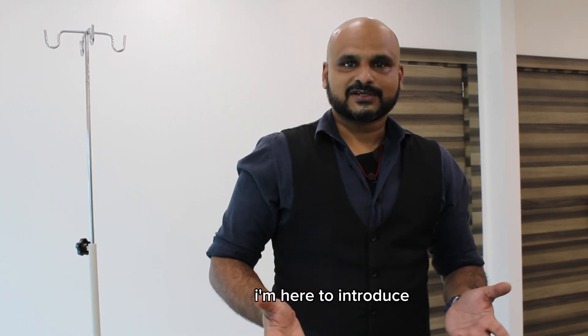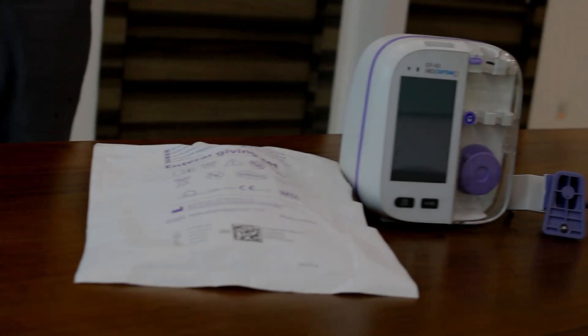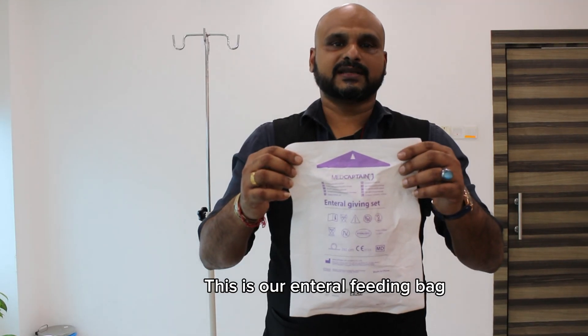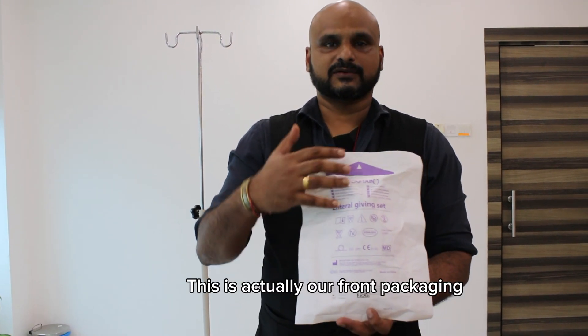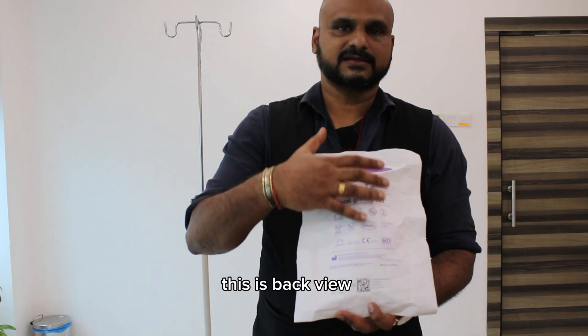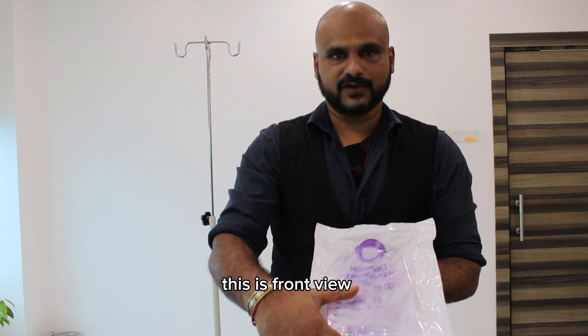Hi, my name is Omar. I'm here to introduce our Medcaptain feeding pump. This is our enteral feeding bag from Medcaptain. This is our packaging — as you can see, it is actually a sterile packaging. This is the back view and this is the front view.